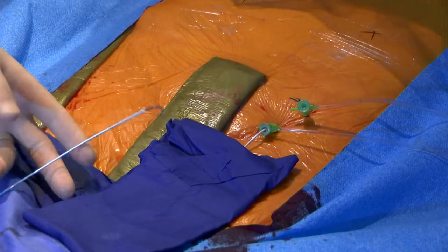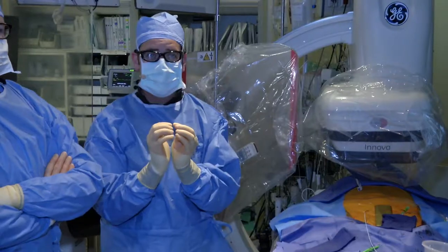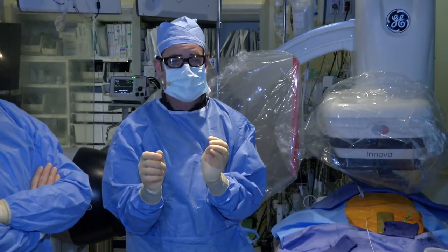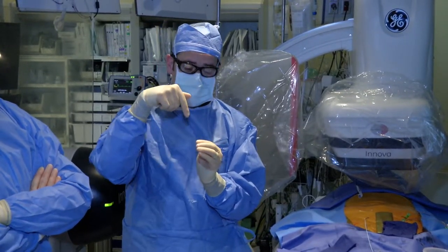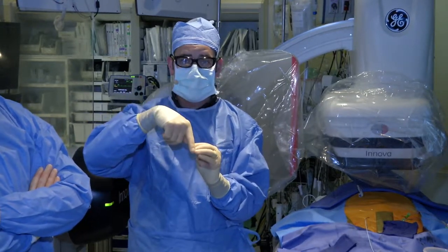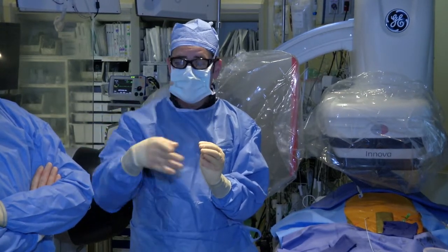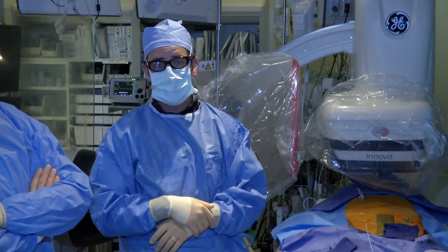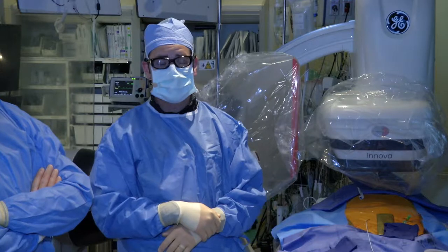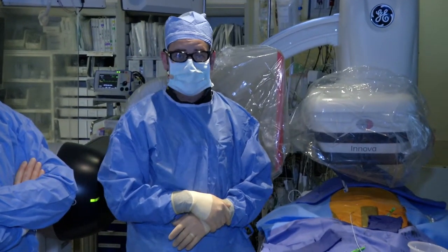Some people like to use ultrasound. The problem we have with ultrasound is that it's very hard to get a precise stick right in the center of the anterior wall of the artery. And the device I showed you a few minutes ago, the Perclose, is designed to work when the access site is exactly in the center of the artery and the entry angle is 45 degrees. So if you end up with a sidewall puncture or the angle is too shallow or too steep, the device may fail, and then obviously that's a problem for the patient. We can have bleeding issues or have to have surgical repair or something like that. So we'd like to do this under direct visualization for that exact reason. So we'll walk you through that.